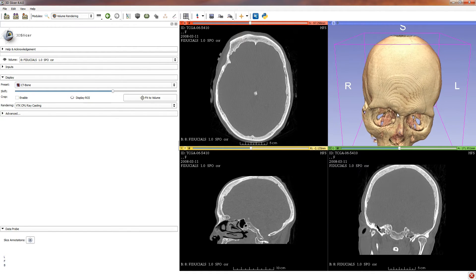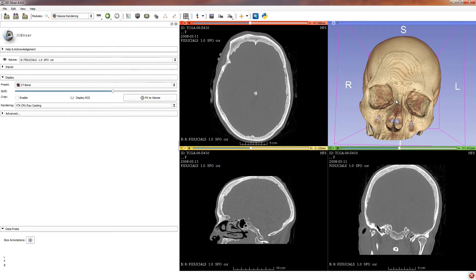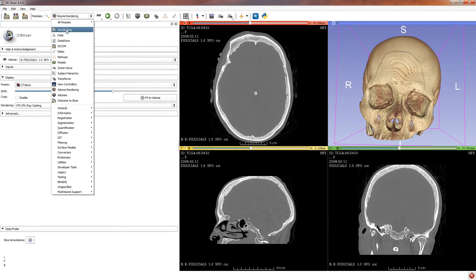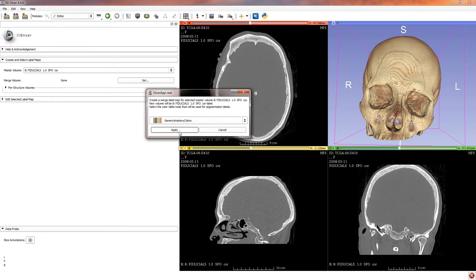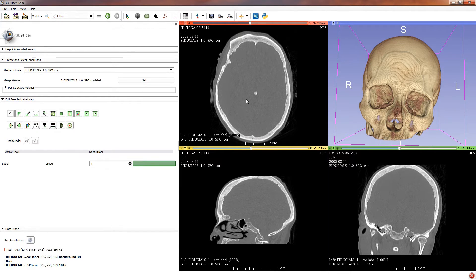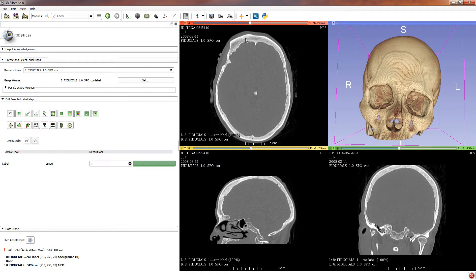Slide the slider to the right until everything looks appropriate. You can use the right mouse button to zoom in and the left mouse button to rotate your 3D render. Next, go to Editor — select editor from the modules dropdown. Generic anatomy colors is fine, just click apply. This will take you to the editor tool panel. What we're going to do is select the bone and create something called a label map. In a later step, that will tell Slicer to create a 3D surface model which we can export into the STL file format.